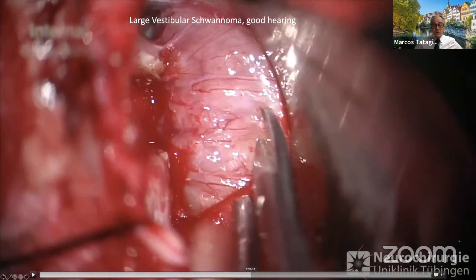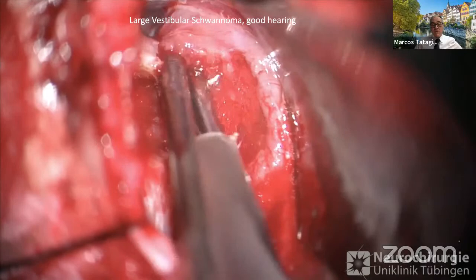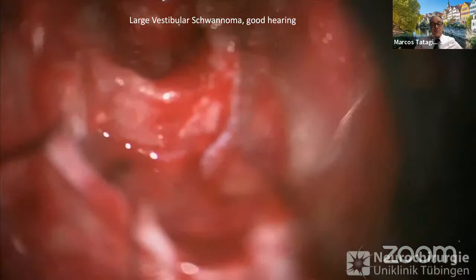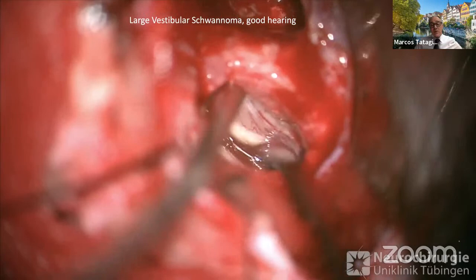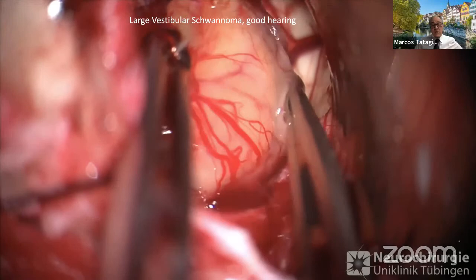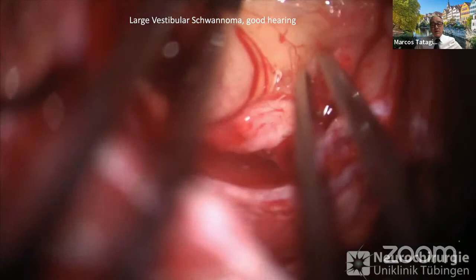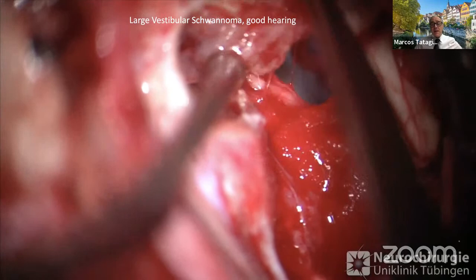So I go a little bit faster to show you the further steps. Then we make a debulking. And then we can be very comfortable here because within vestibular schwannomas, there is no nerve, there is no vessel, nothing different than meningiomas. And then after debulking, we can recognize the cochlear nerve. The cochlear nerve is visualized. And then we start the same type of dissection I have demonstrated earlier. You see the facial nerve and the cochlear nerve with irrigation using papaverine. And we touch only perineurium and arachnoid. And slowly, slowly, the tumor is dissected.